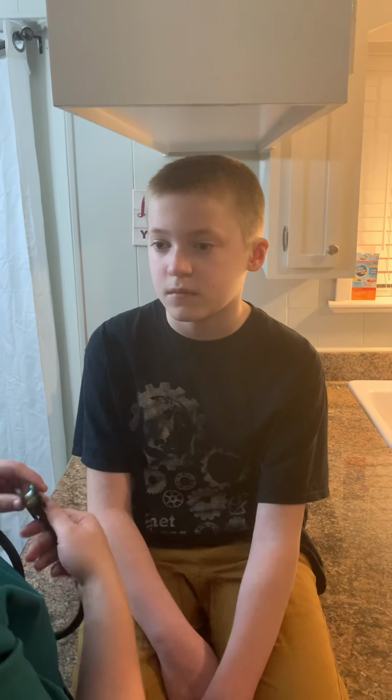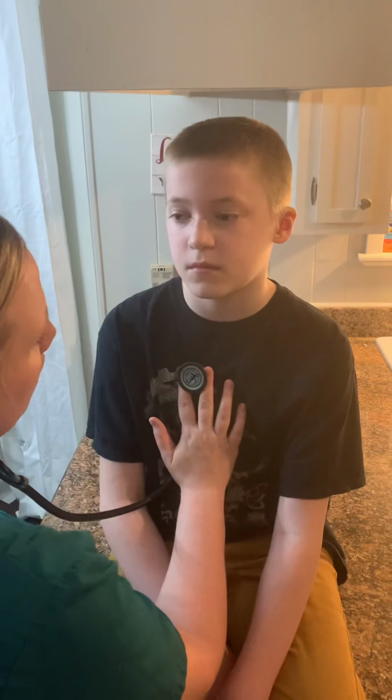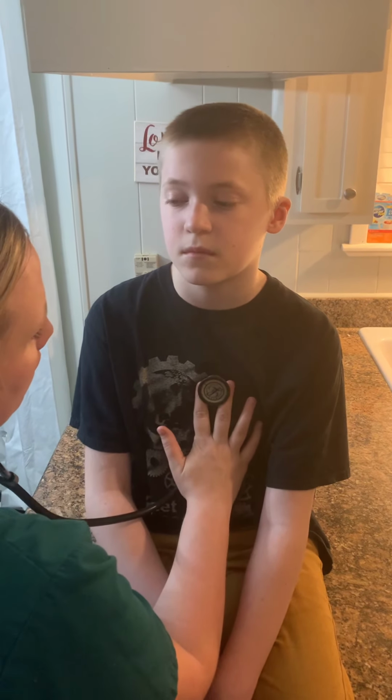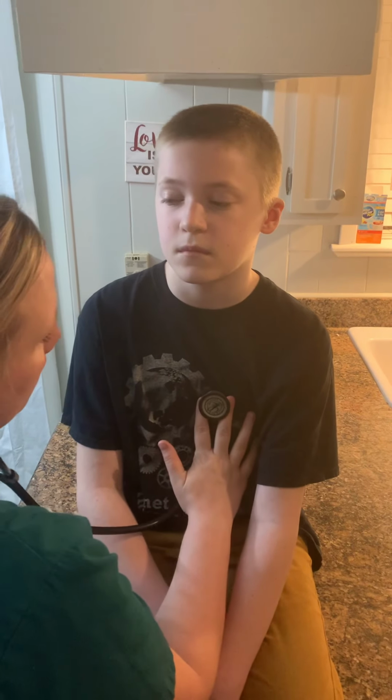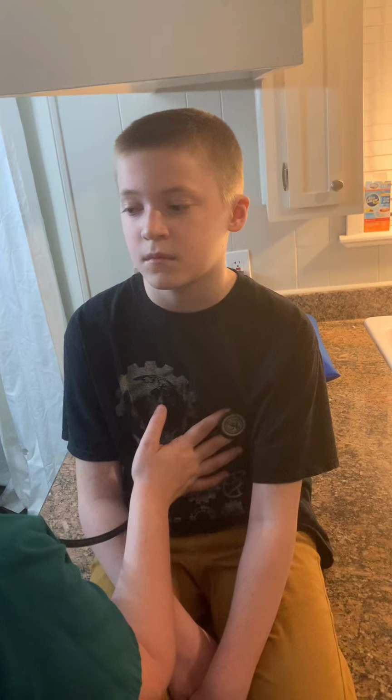Great. So now I'm going to listen to all the same spots again with the bell of my stethoscope, okay? I'll just call those out again. So we have your aortic, pulmonic, Erb's point, tricuspid, and your mitral. Perfect.